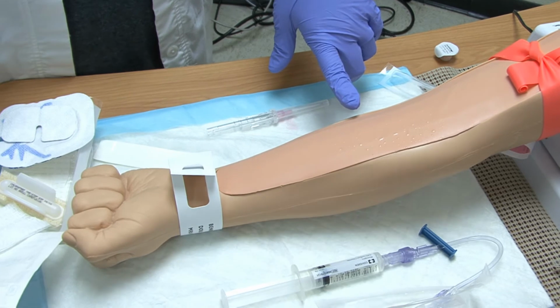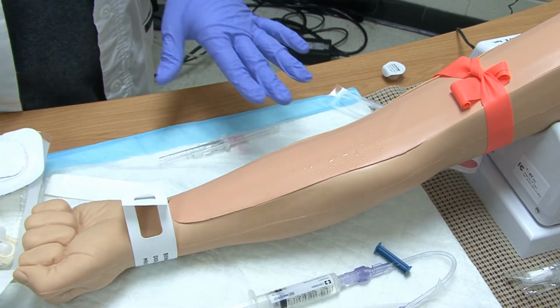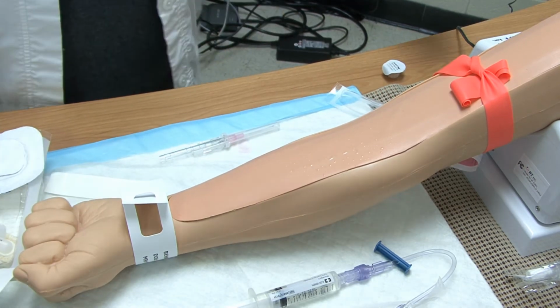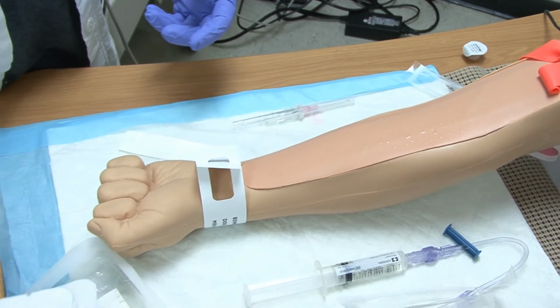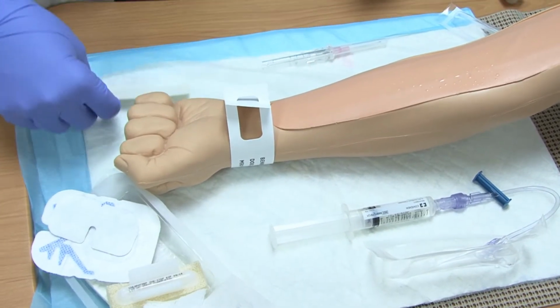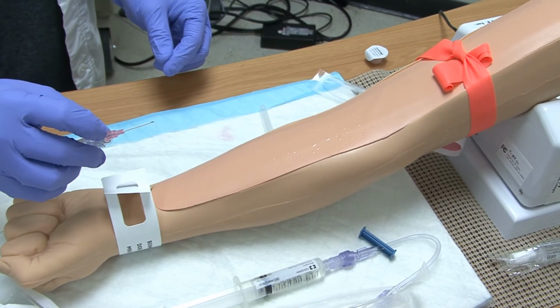Once I have cleaned the site, I need to make sure that I do not touch the site again. If I do touch it, it's contaminated, and I need to clean it again. So I'm going to make sure I've got everything in position and ready for me, so that whenever I'm ready to start, I have things there and I'm not going to contaminate my site. I'm going to go ahead and take the cap back off of the needle.